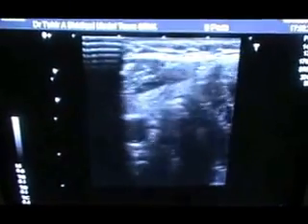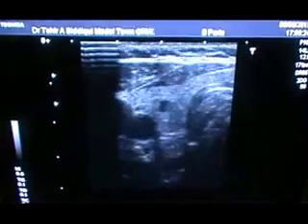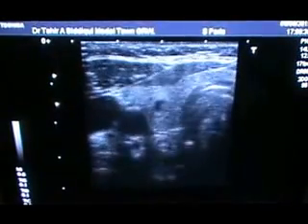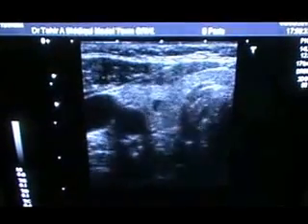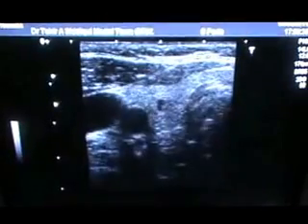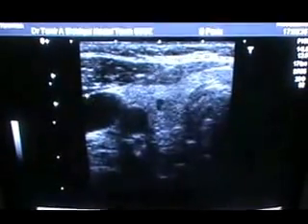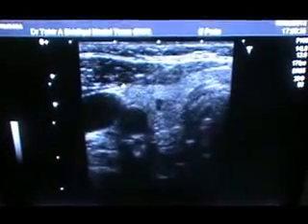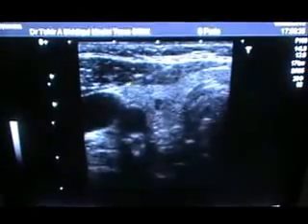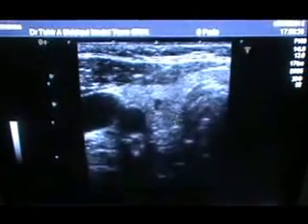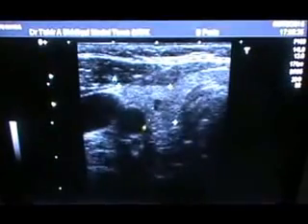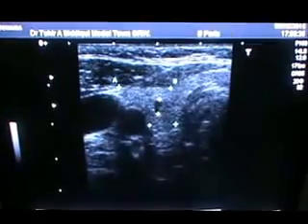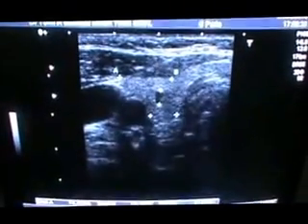Here in the transverse section you are seeing the thyroid. This is an ultrasound of a thyroid gland of a 55-year-old female. In this view, this is the common carotid artery and this is the internal jugular vein — the landmarks for identification of the lobe of the thyroid. This is the transverse section showing you the right lobe of the thyroid gland. This cystic area measuring approximately 3.7 mm is the parathyroid gland visualized in this region.